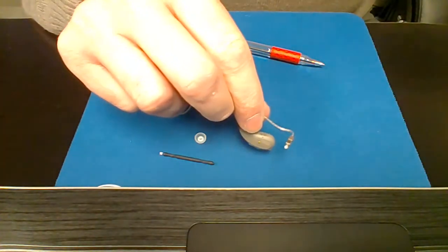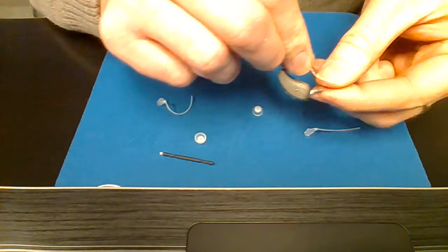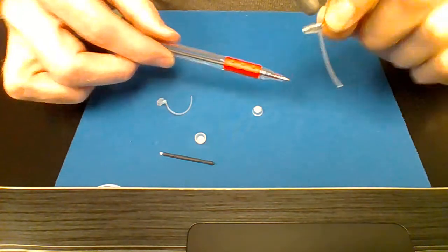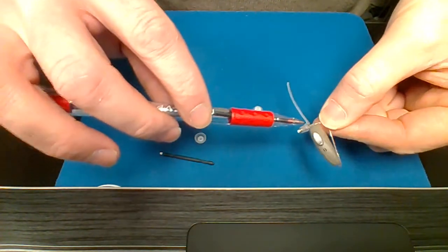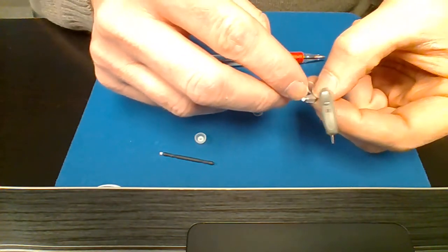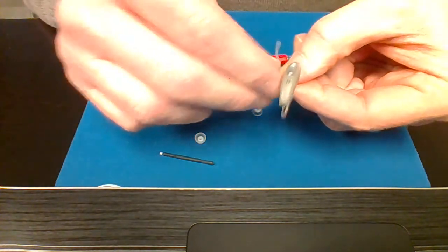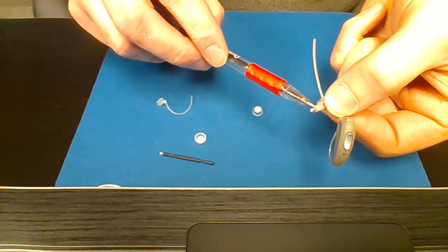Okay, then we go in and put on a new retention wire, which we have right here. We take that retention wire and we put it on just like that, and it just slides over the top of this metal piece that's the receiver. It just slides back on. You want to make sure that this part here is towards the wire. You won't be able to put it on backwards, or not very easily, because this is a tapered end. But you always want to make sure that the long part of the retention wire is towards the wire. Then you push that up until it's seated well, and it goes all the way up till it's past this little nipple here.